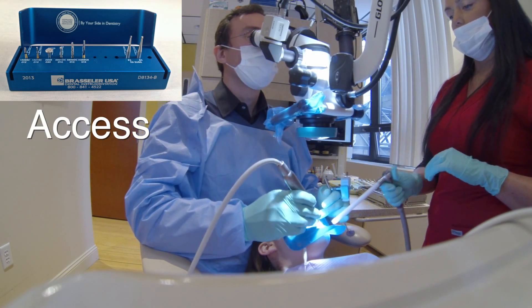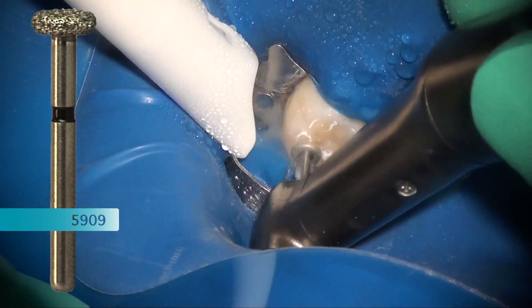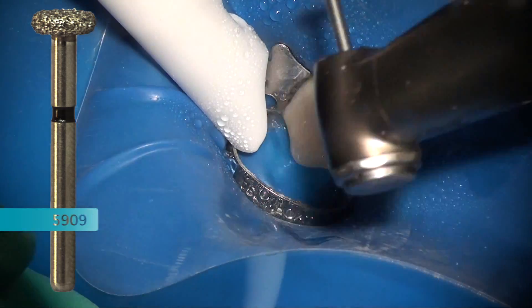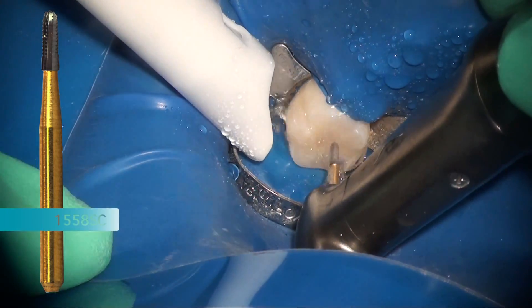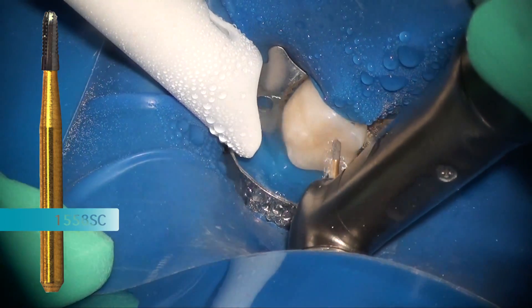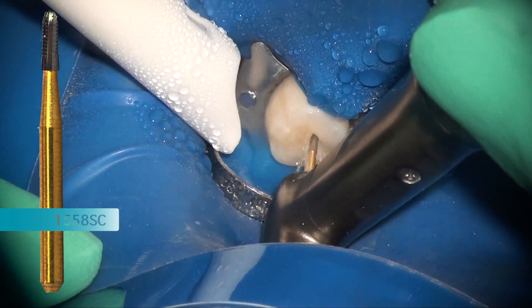To begin the procedure we use our 5909, which is from the Real World Endo access kit. It's a disc diamond that flattens the cusps, gives us nice reference points, and takes the tooth out of bite. We then follow that up with the 1558 saber cut, which is a crosscut fissure bur — very efficient and great for molars. This is my go-to bur for making outline form in the Real World Endo access kit.